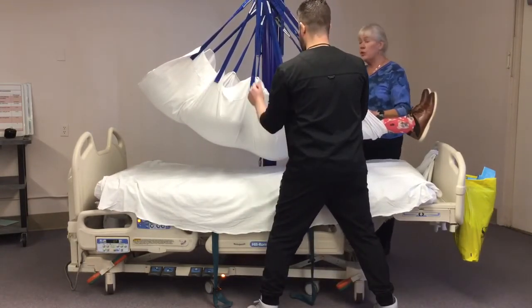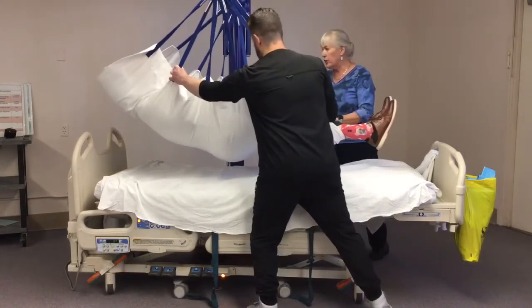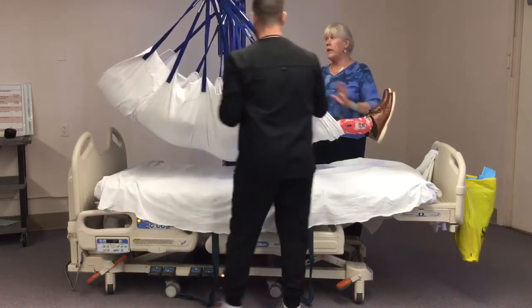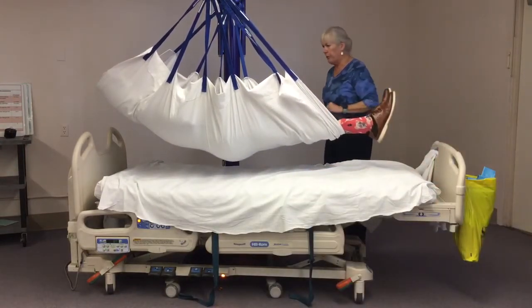I'm going to push the machine from a lower point and push the patient in the direction that I want him to go in, being careful that I keep my patient stable and not rocking. I don't want to push from the top of the machine. I want to push low, okay?